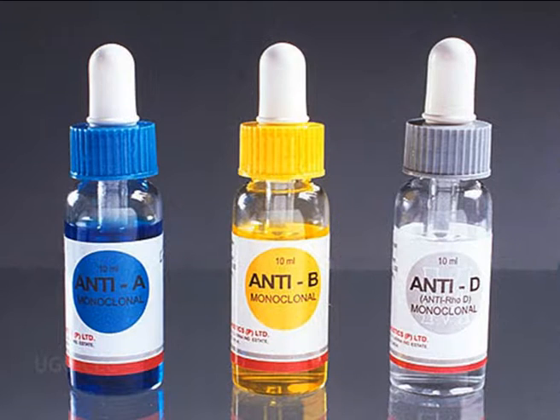In forward grouping, the monoclonal antibodies are available for A, B and Rh antigen. Monoclonal antibody against antigen A, also called anti-A, the monoclonal suspension being blue in color. Anti-B comes in yellow color. Anti-D, that is monoclonal antibody against Rh, is colorless. All the color codes are universal standards.